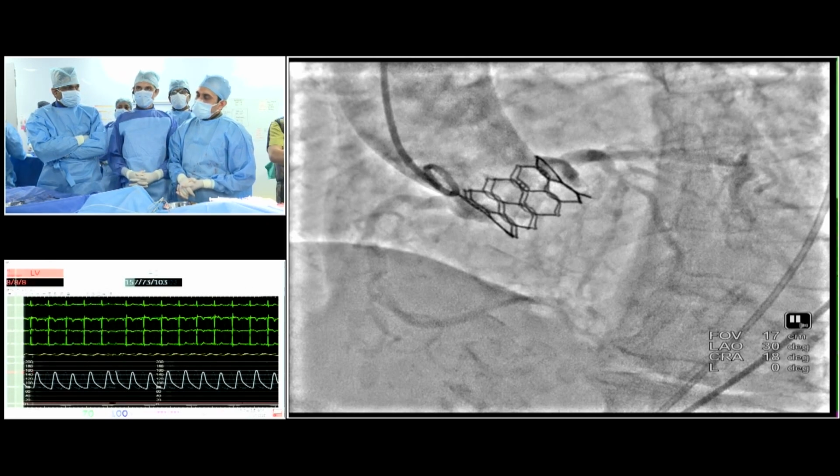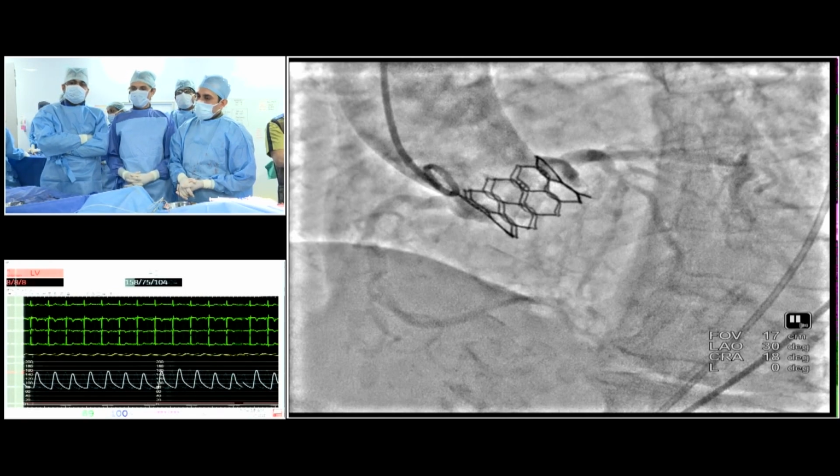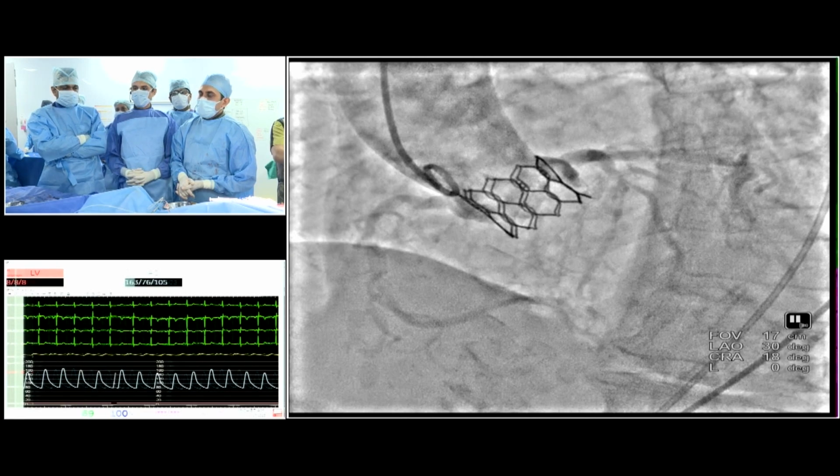Reviewing the 125 cases, I saw only 9% of post dilatation, and it's basically not because of anything like recoil, but just to increase the diameter of the valve a little bit because there was a small degree of regurgitation. No, I think it's quite impressive.